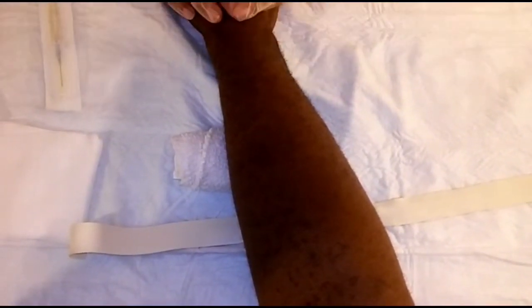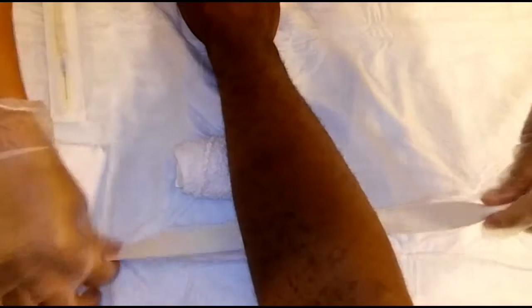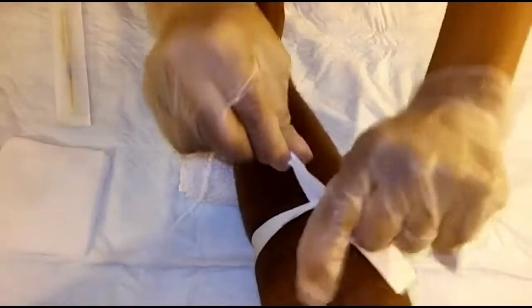Now you have to select the vein in which venous access will be inserted. Apply a tourniquet and look for the vein.